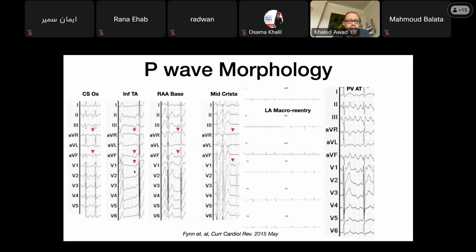And by the way, understanding these principles helps you so much in VT. EP is all connected. It's all a connected mesh. You have to understand the principles, and then you apply it to anything, and it works most of the time.